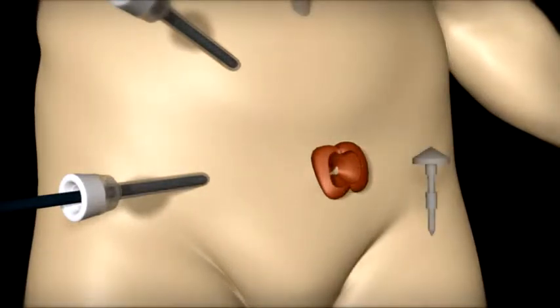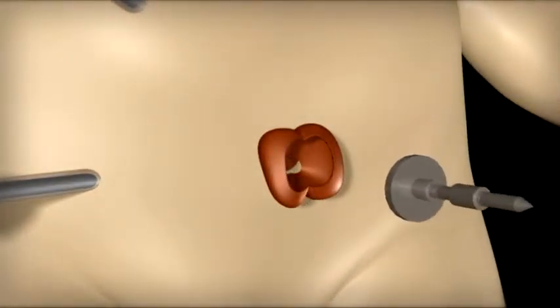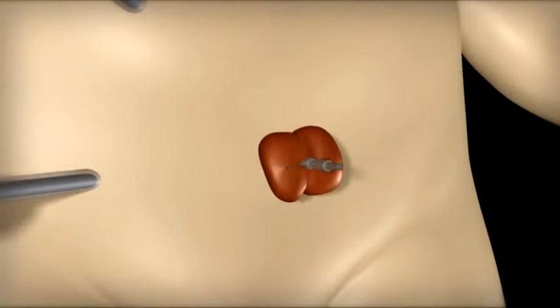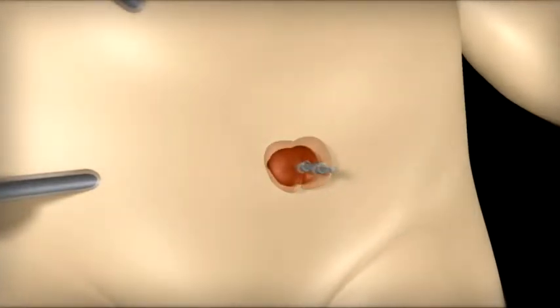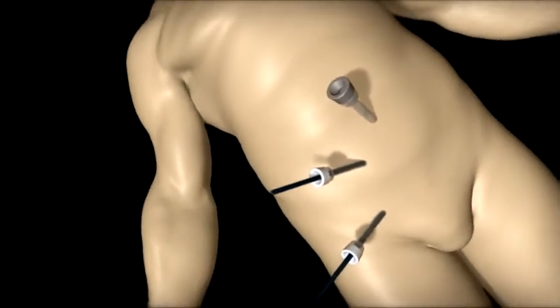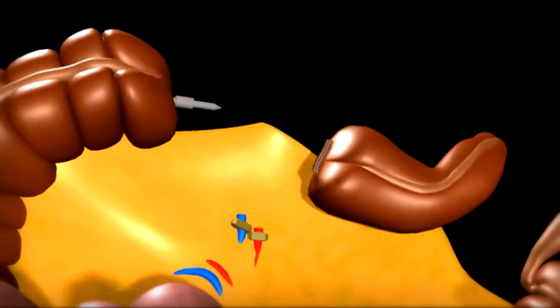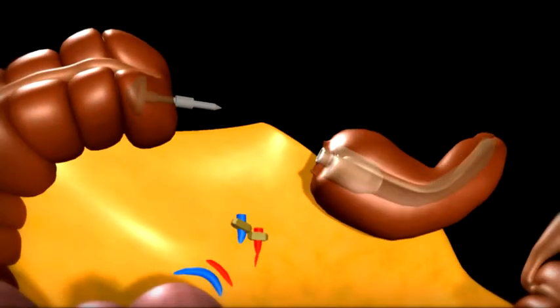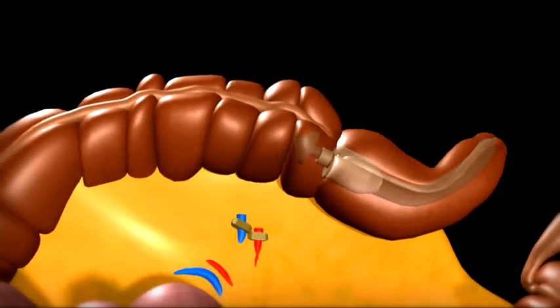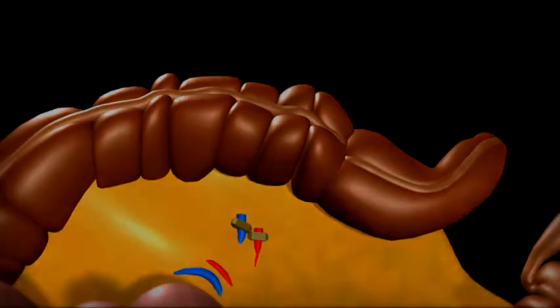The top half of a stapling device is then placed in the colon, and then the colon is returned into the abdomen. The laparoscopic part of the procedure is resumed. The bottom half of the stapling device is introduced into the rectum, coupled with the top half and then deployed, reestablishing the continuity of the colon with the rectum.